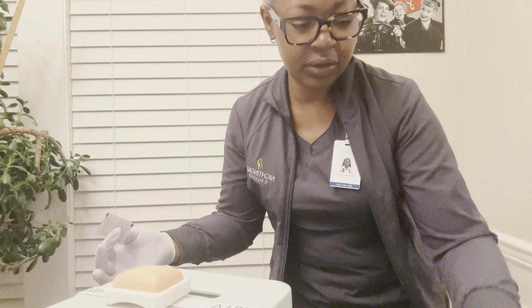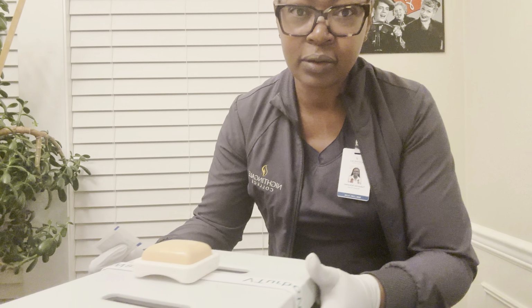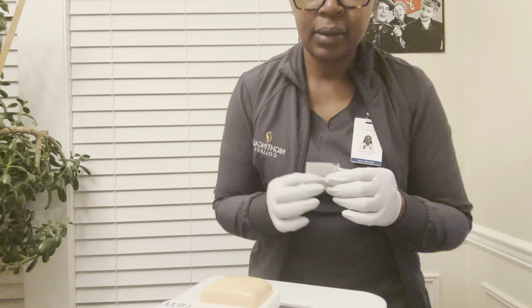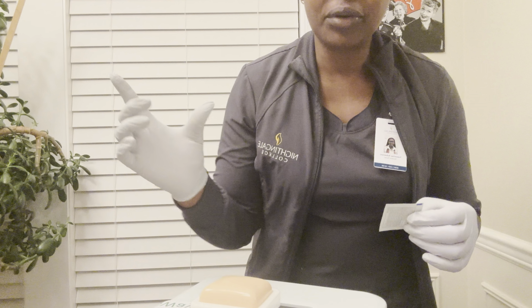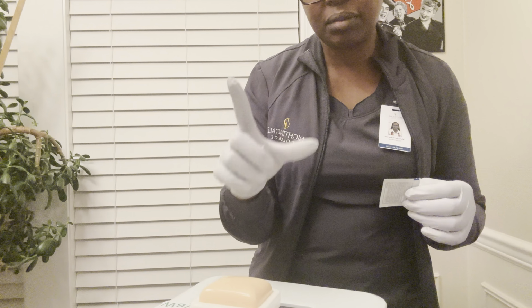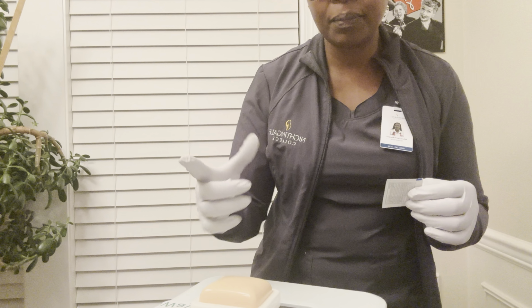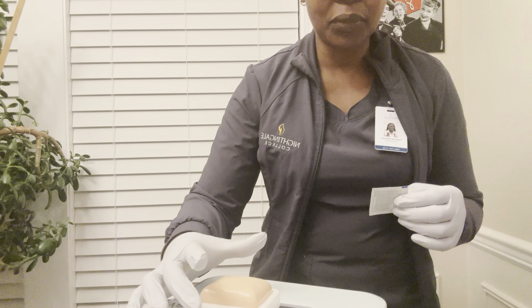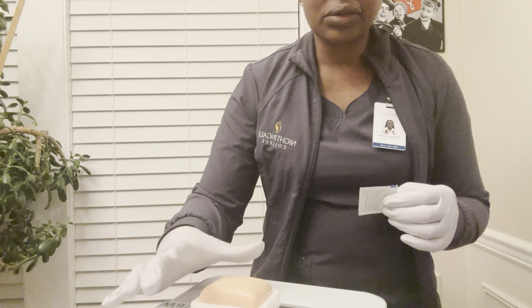I want to move this a little bit closer to the camera. So what I'm going to do, I'm going to use my pointing finger and my thumb on the trochanter of the ventrogluteal area.